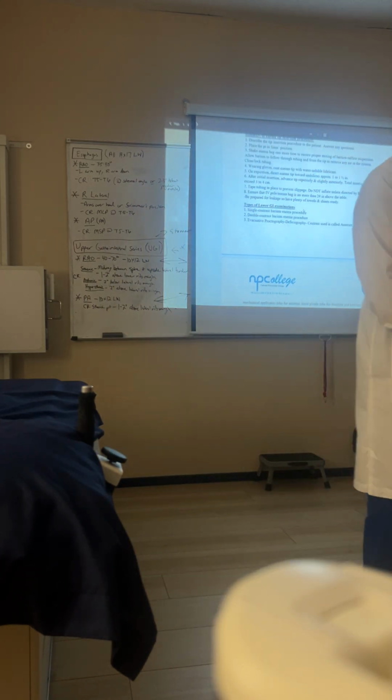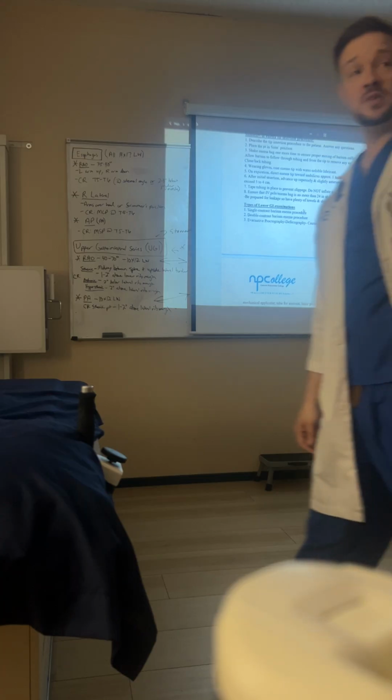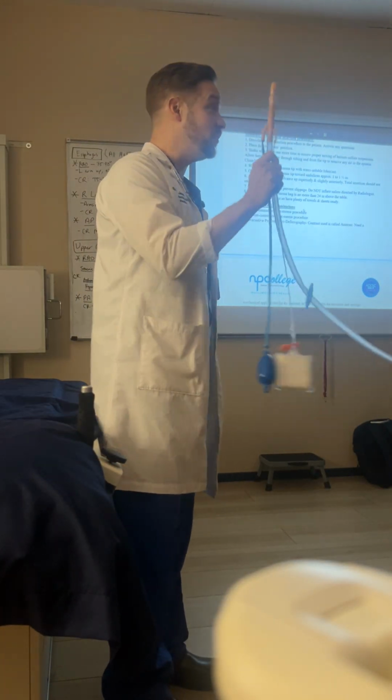Okay. Also show them the tip. Tell them this is what's going to happen, and tell them how much. So we're going to use this tip, and I kid you not, I know it's happened to you too. I show it to the patient. That whole thing's going in?